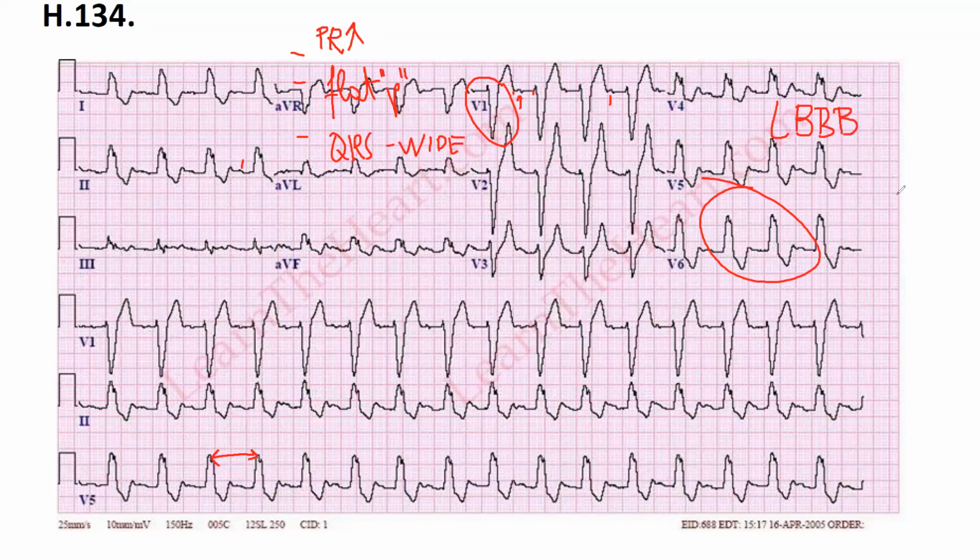Pathological Q wave? We'd be looking at where you can see a deep Q wave.